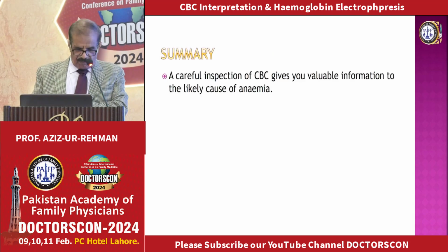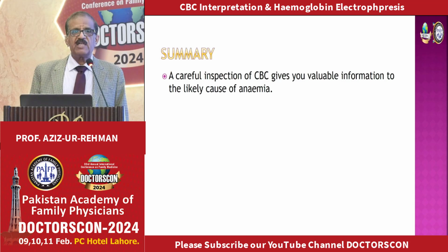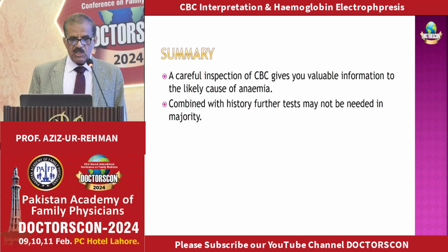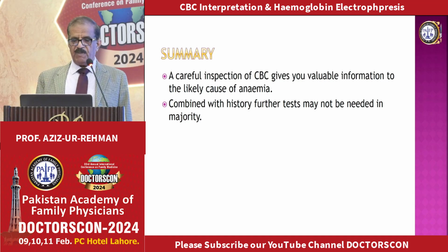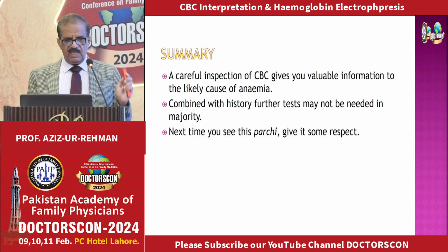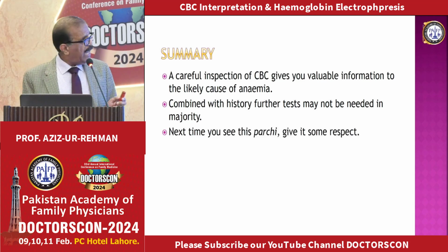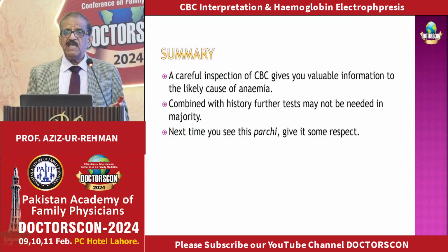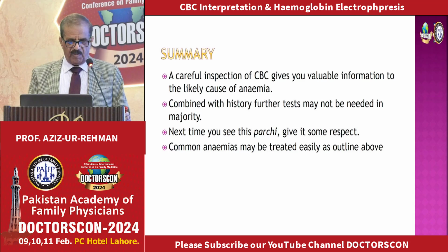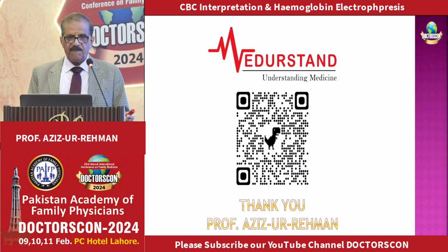So to summarize, a careful inspection of the CBC gives you valuable information on the likely cause of anemia. Combined with history and physical examination, further tests may not be needed in the majority of cases. So you can save resources, you can save money, you can save time. And next time you see this little report, please give it some more respect. Examine it carefully and it will give you a wealth of information. All common anemias may be diagnosed easily and treated easily also.